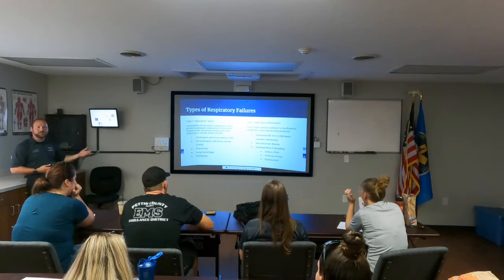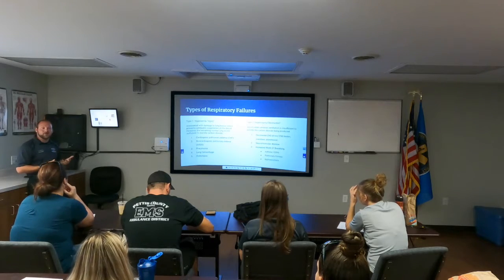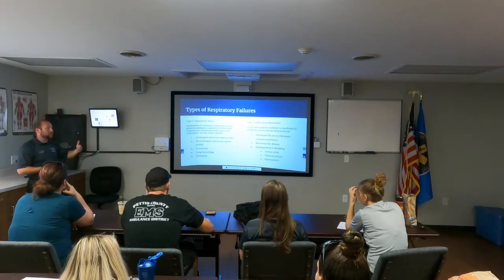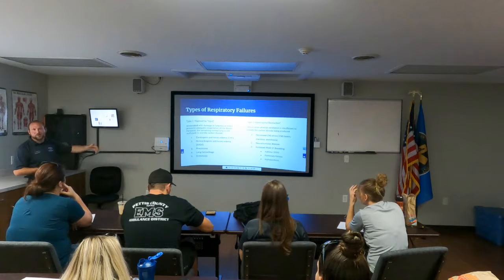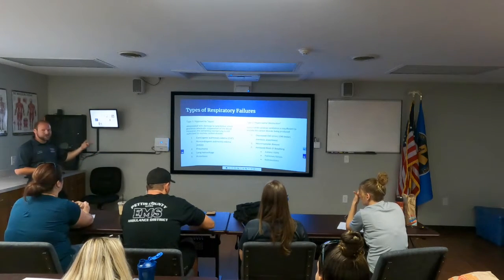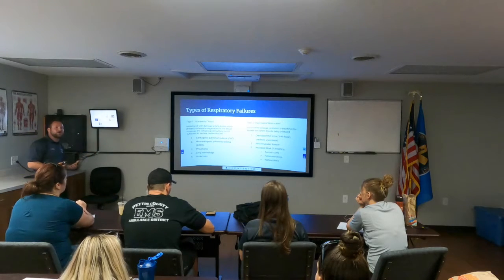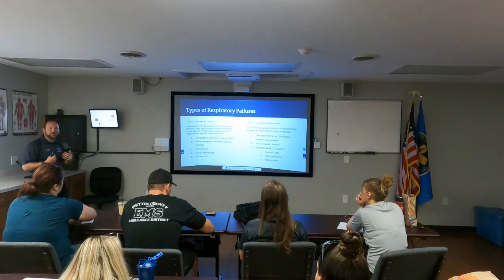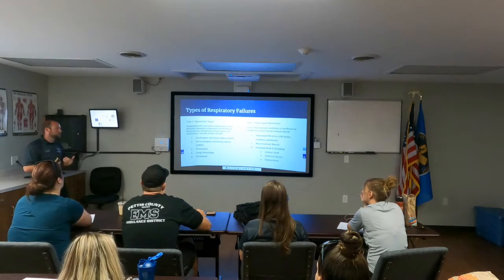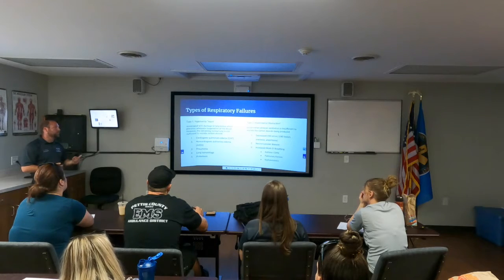So something else we consider when we do our RSI, DSI intubations is knowing that we are technically putting them in an obstructive type 2 respiratory failure, just considering that when you set up your vent. Neuromuscular diseases like Guillain-Barré, anything that's going to cause the drive to breathe to decrease. Increased work of breathing are asthma and COPD, pulmonary fibrosis.